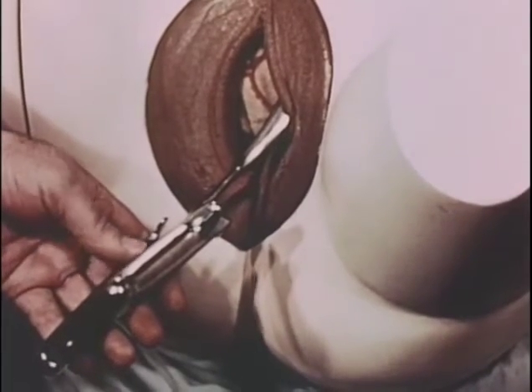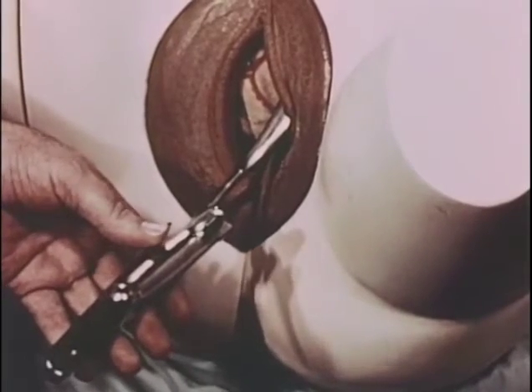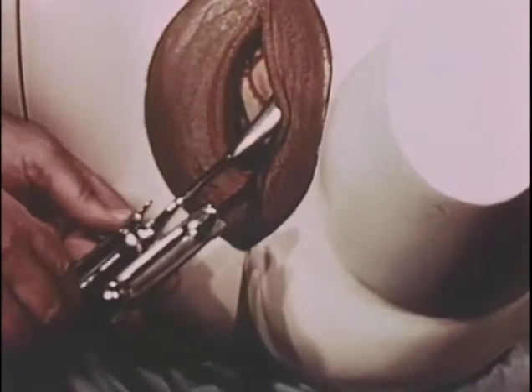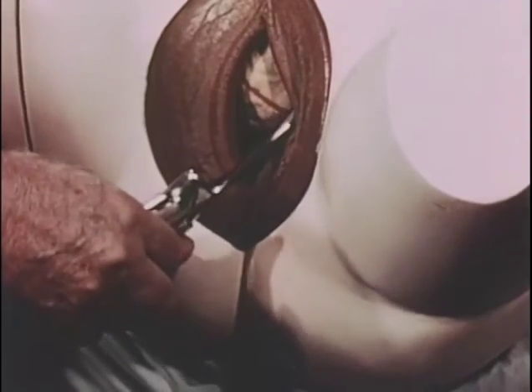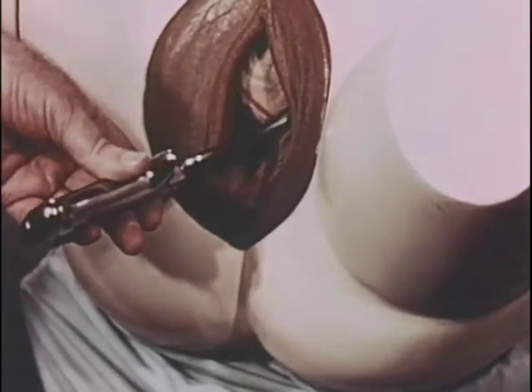The handle comes to rest opposite that of the posterior blade, but as you see, it cannot be locked because the lock is on the handle of the left blade, and it's necessary to cross the handles in order to lock them. This is considered by some as a disadvantage.